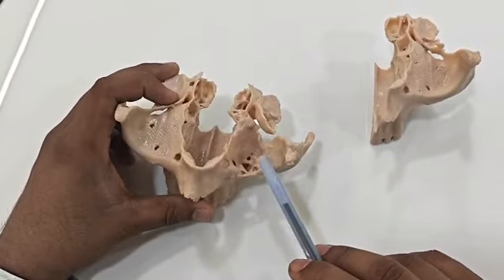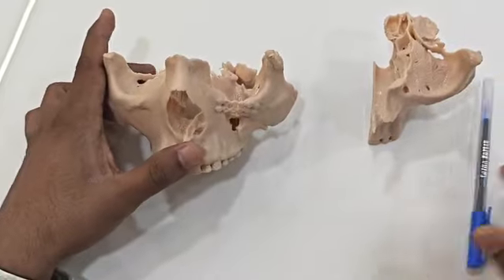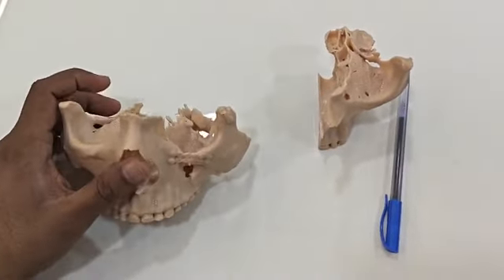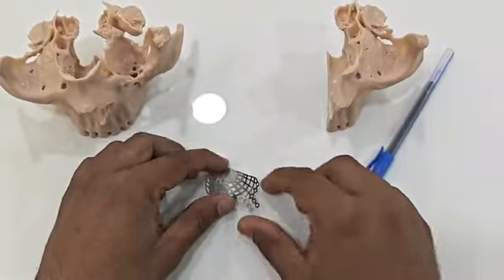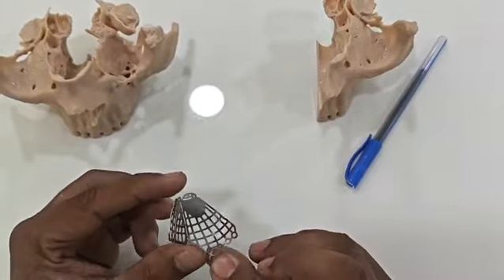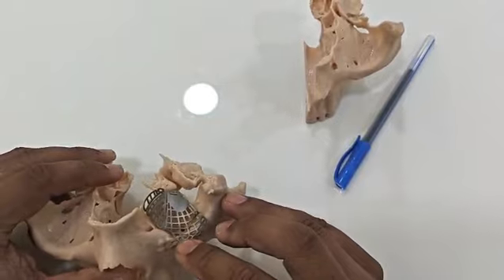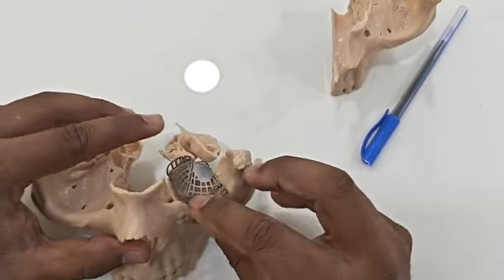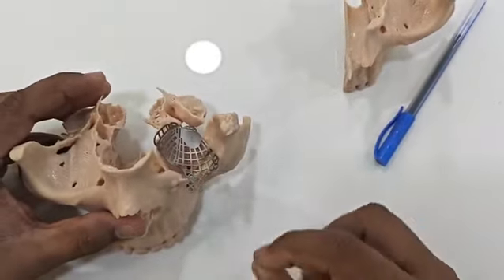There will be no more surprises because we already know there is a huge defect in the floor of the orbit. So there are two plates which we are planning to carry. If you see this plate, this is a KLS Martin 3D reconstructive plate of the floor of the orbit. We have already pre-bent it but not cut it totally. If I place this plate like this, it is almost covering the entire defect.